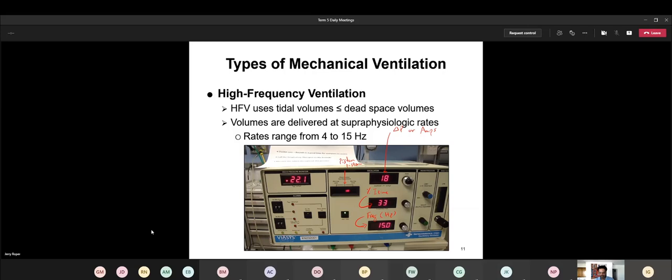And then down here, these yellows are definitely still an alarm situation, but maybe not as high priority. And that could be something related to the internal battery that it has. That's an alarm that will go off. And then there's the overheat. Like this thing is getting too hot and it just switches off.